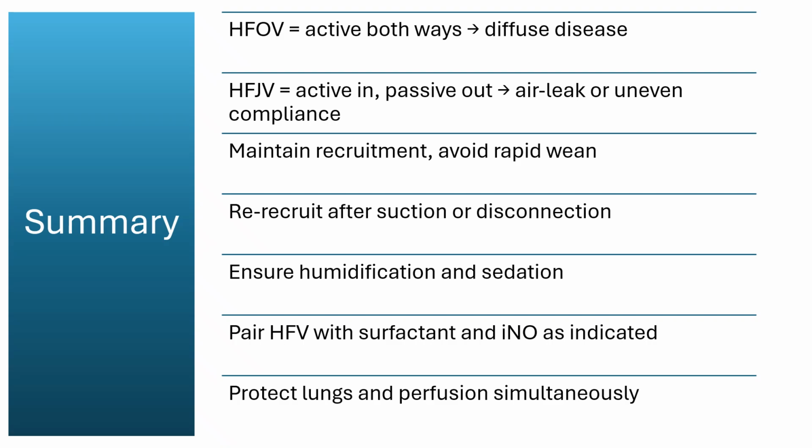Pairing high-frequency ventilation with surfactant or nitric oxide therapy, when indicated, improves oxygen delivery and vascular stability. The central objective remains the same across all high-frequency modes: protect both lung structure and systemic perfusion. By keeping the lung open, minimizing pressure swings, and coordinating respiratory and circulatory management, high-frequency ventilation supports effective gas exchange while preventing the progression of ventilator-induced injury.